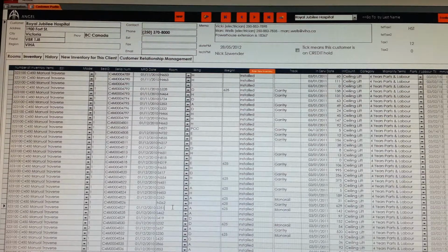Now, basically, this record for this lift is 100% accurate. We've been to the facility last week, we verified, so now we have achieved our goal of updating the data. And the cycle count is a big one. A lot of facilities like to know that information, so we can provide them spreadsheets later on with all that info on it. So I think that pretty much covers it.